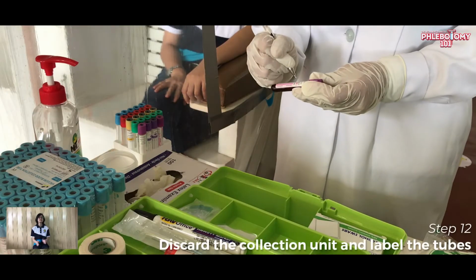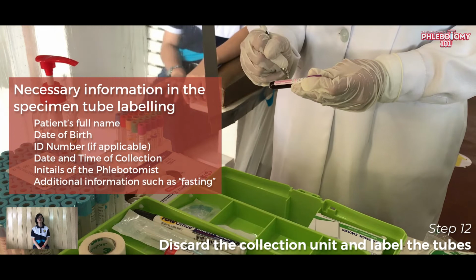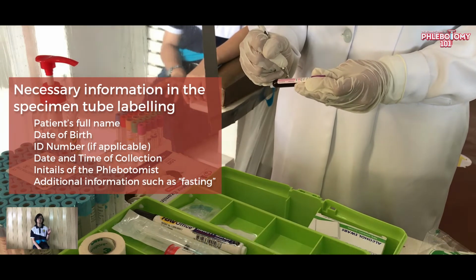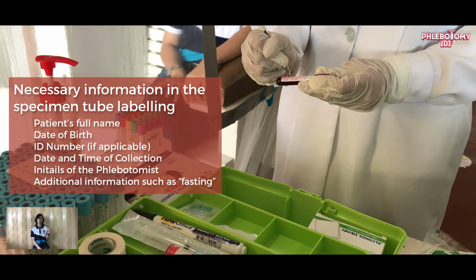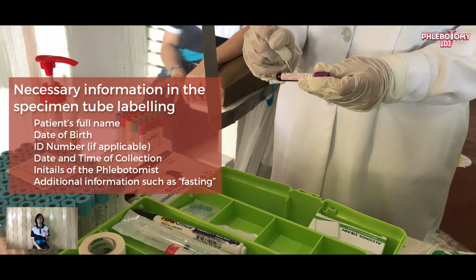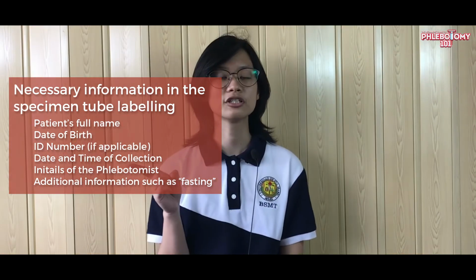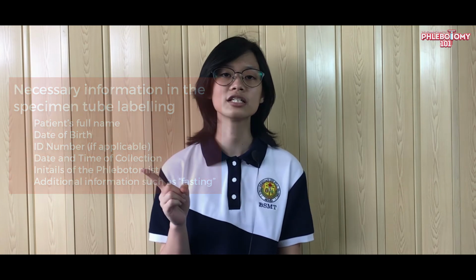Step 12. Discard the collection unit and label the tubes. The necessary information is as follows. The patient's full name including the middle initial, birth date, and if applicable, the patient's ID number. Kailangan din ilagay ang date and time of collection, initials ng phlebotomist, and additional information halimbawa kung fasting specimen ang kinuha, indicate na fasting.